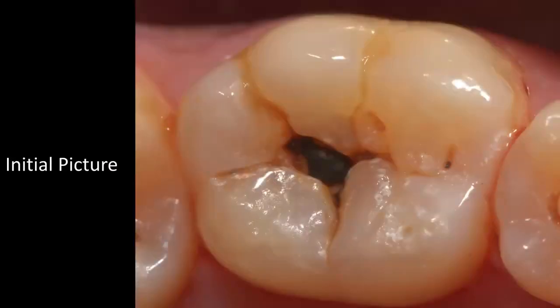Looking at another case in which we are going to see the initial lesion. As you can see, there is a break in the integrity of the enamel, and the lesion is spreading towards the DEJ level. By looking, it seems to be a very small cavity, but remember, enamel lesions are usually V-shaped cavities with a V-shaped neck on the occlusal surface and the broad base towards the DEJ. When you start removing such cavities, they're going to grow bigger.